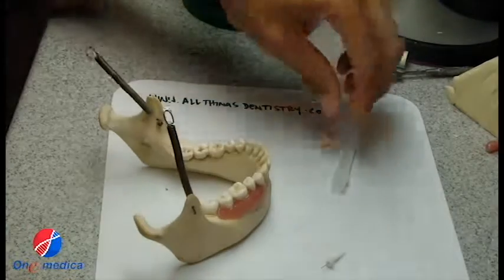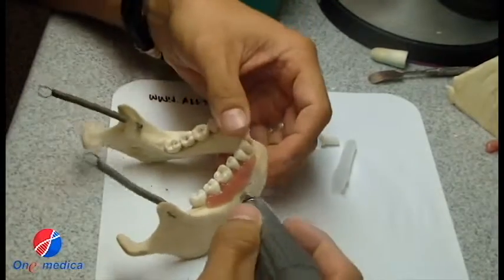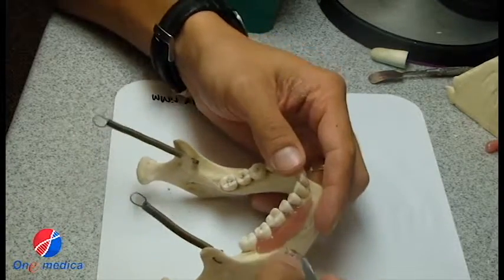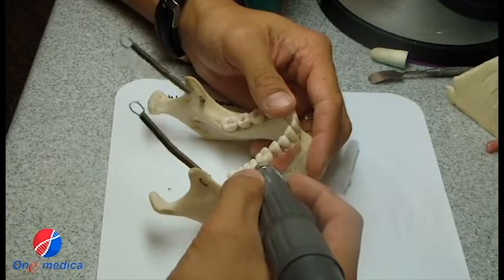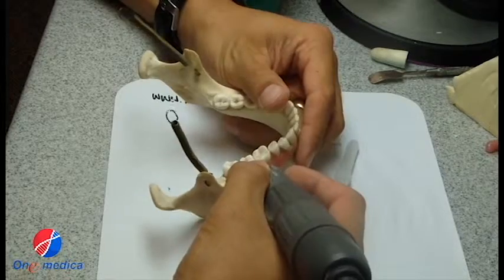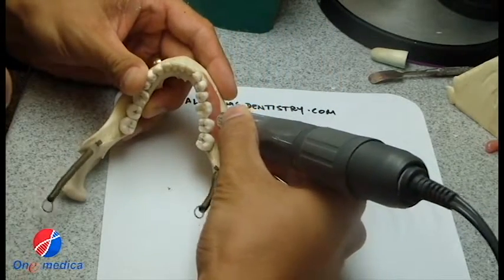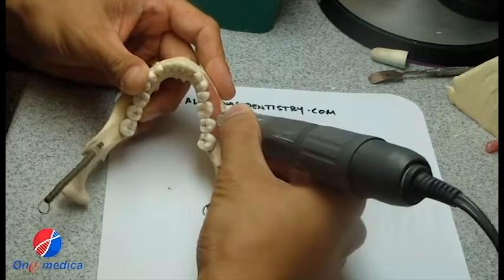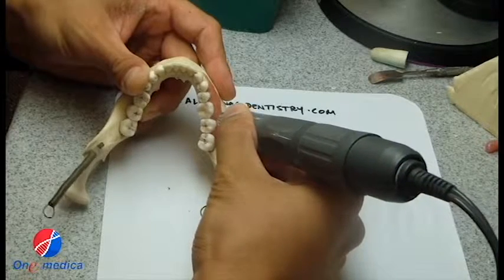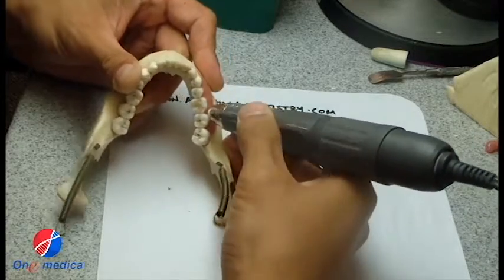Okay, here we go. We're going to put this in here. Typically for intraosseous, you're going to want to go posterior to the tooth that you need to. However, it's really tough to get back here. So I'm just going to find, this is exactly what I do intraorally, and I take the perforator, I spin it as I go in, and then boom, you see how it just dropped.